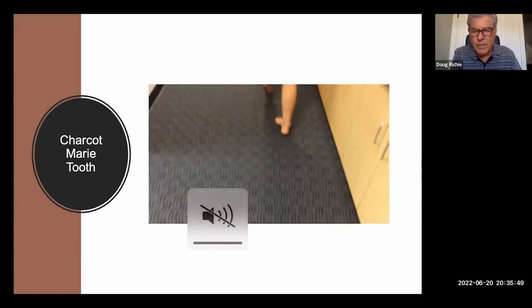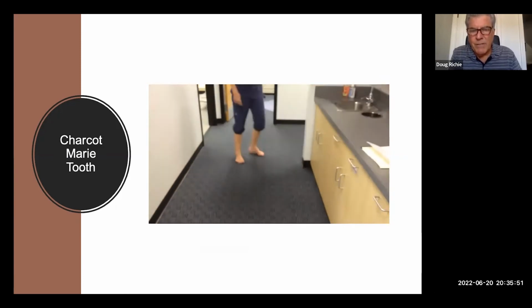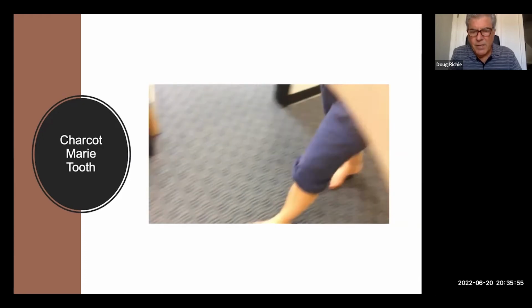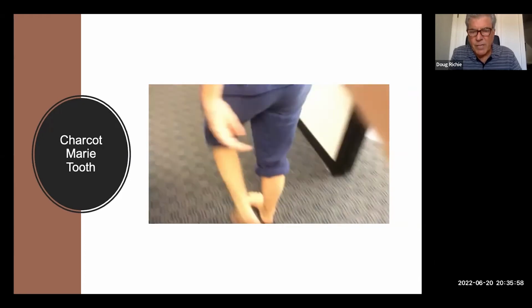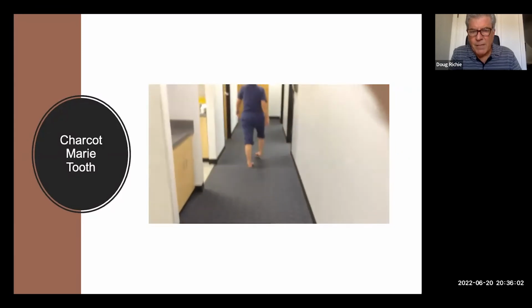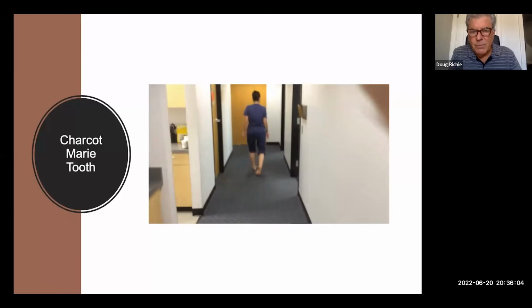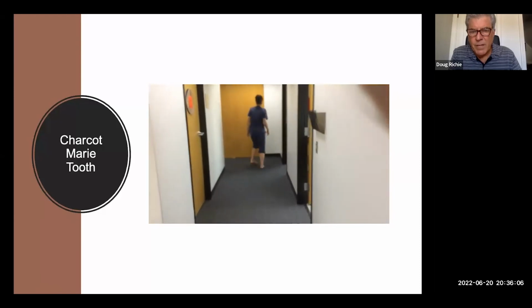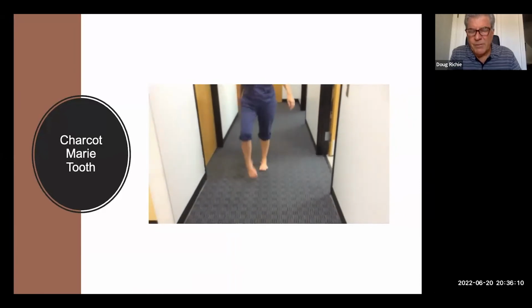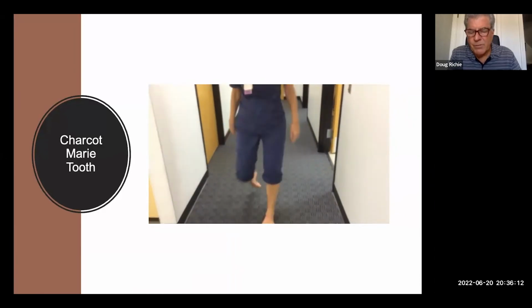I'm going to turn the sound up. Bilateral flaccid drop foot compensated with a steppage gait, a significant varus rotation of the feet and ankles during swing phase, and maintenance of an inverted supinated varus deformity of the hindfoot during mid-stance. She had been fitted for standard AFO braces, which she found bulky and uncomfortable, particularly in her duties as a floor nurse.